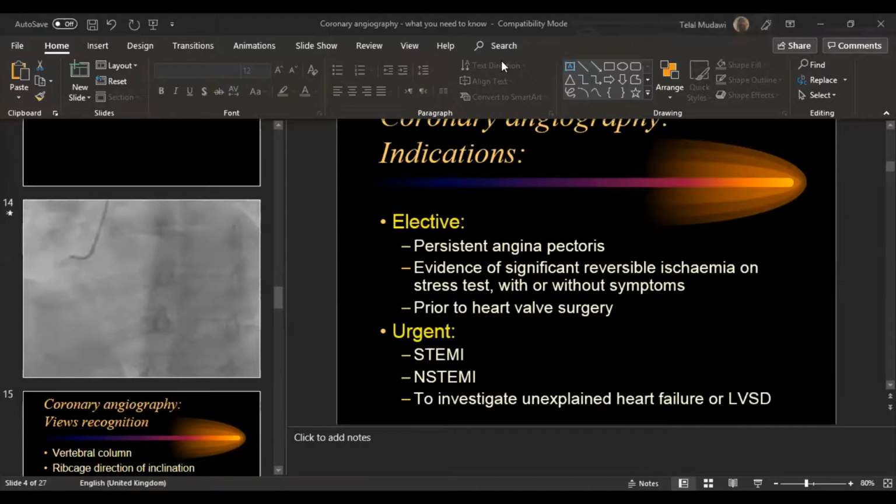بتبقى بس طبعا تجي difficulties في حالة الانوماليز، كوروناري انوماليز وكده، فما بعرف هل بتتعرض لها فيما بعد. بصراحة يعني sometimes بيطلبوا مننا بعض الكيسز، we used to give them anomalies. This is not خباثة مننا to make it difficult، لكن I think it is needed because they face these cases. It is not something advanced.